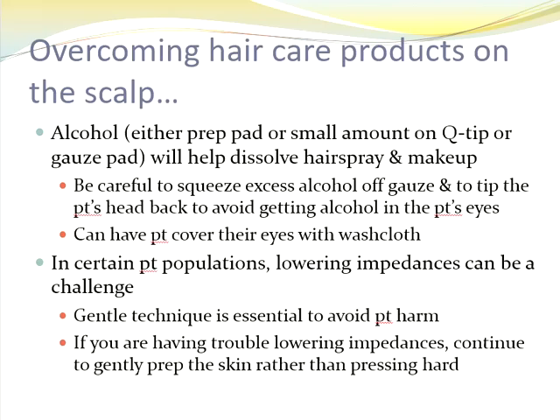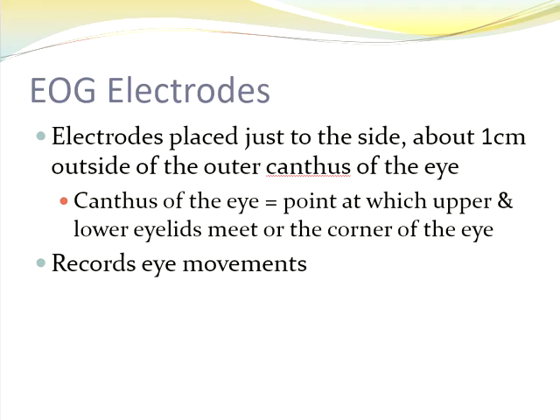If you're having trouble getting a good signal, lowering the impedance level good enough, just keep at it. Keep gently prepping it versus prepping it harder. Prep it for longer than, take that top layer of skin off.